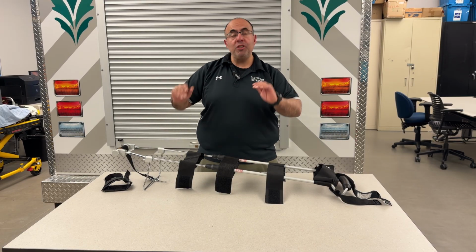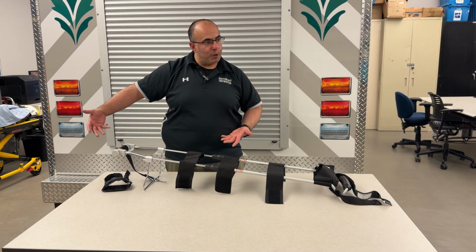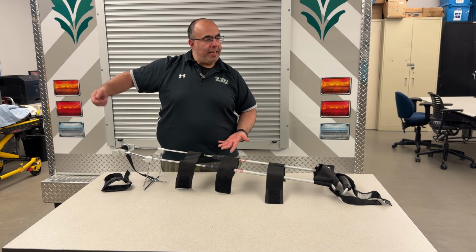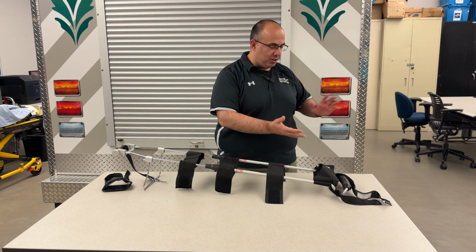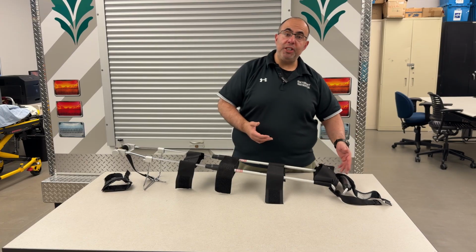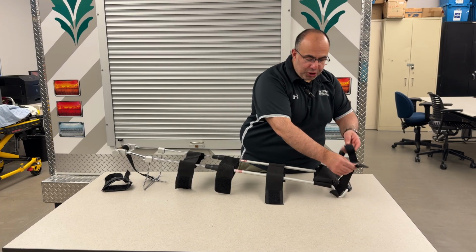So now my securing straps are set up. I have the proper distance. My rescuer, my partner, is holding manual traction. He lifts up his leg a little bit higher, and I insert this right underneath my patient's butt. Again, all the way up to the ischial tuberosity. From there, I apply the ischial strap, first strap.